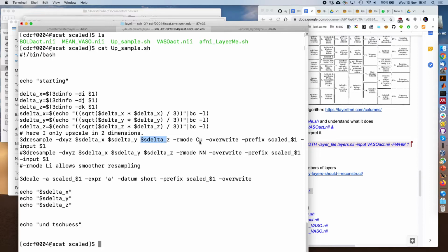When we have a streamline like that, yesterday Jonathan said this would correspond to a step function: this has a certain value, this has a certain value, then this, which results in this kind of pattern. But this inherently assumes that the signal intensity is homogeneously distributed in the voxel, which is not how the brain works. You don't have sharp edges of voxels.